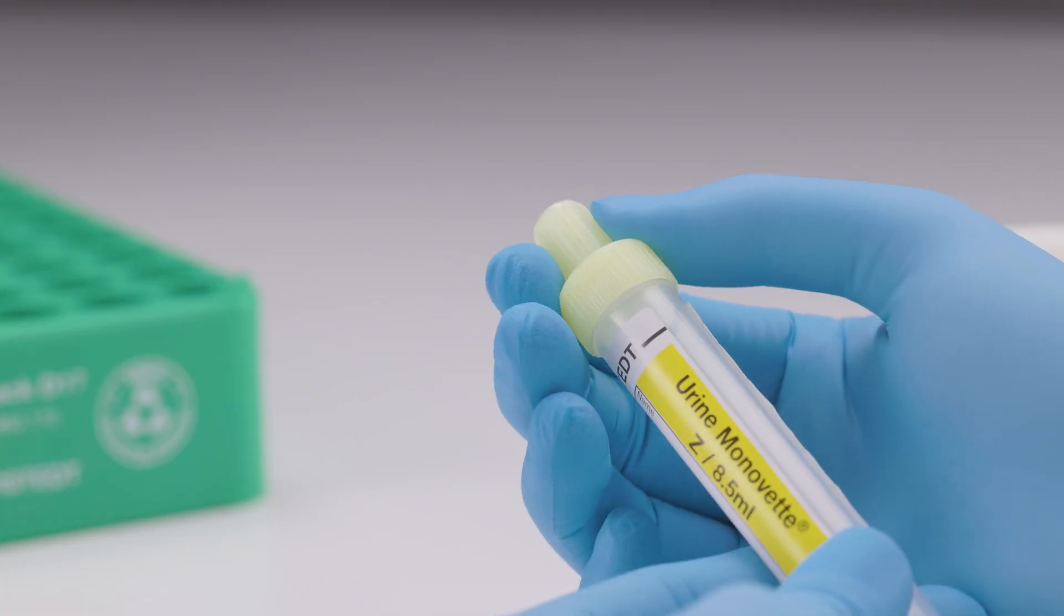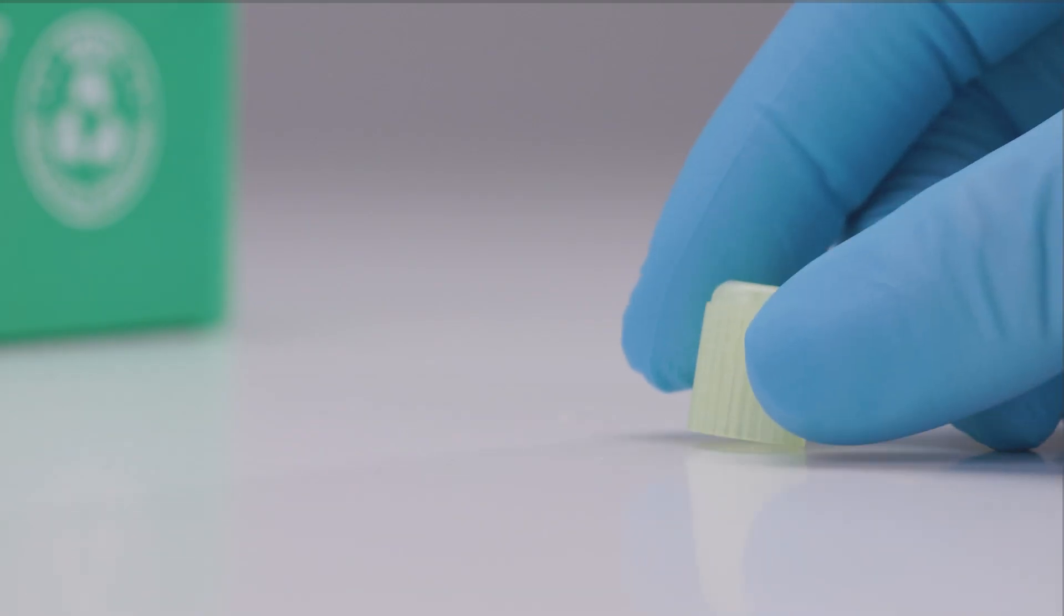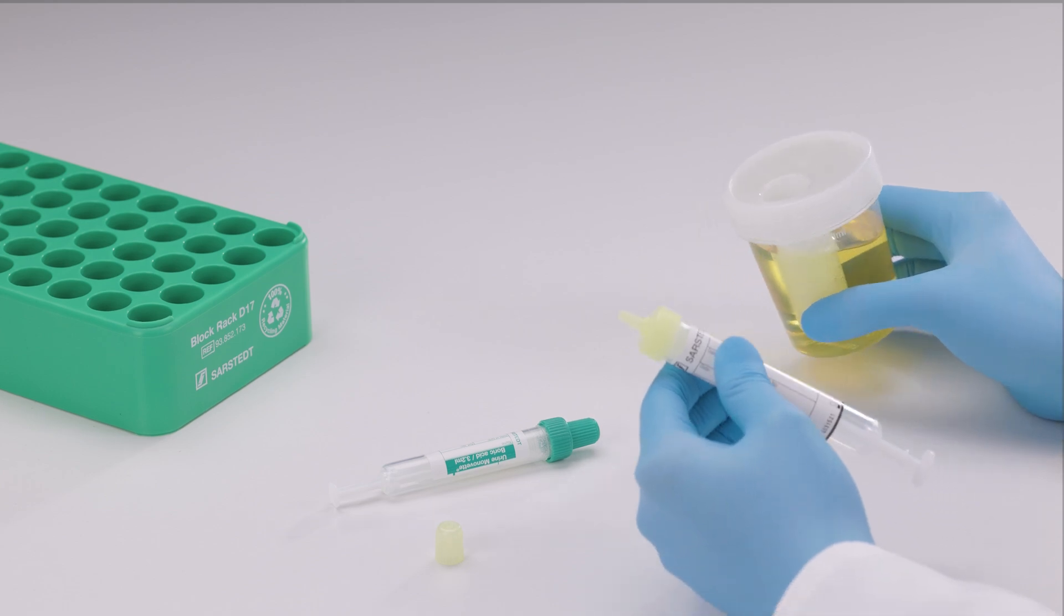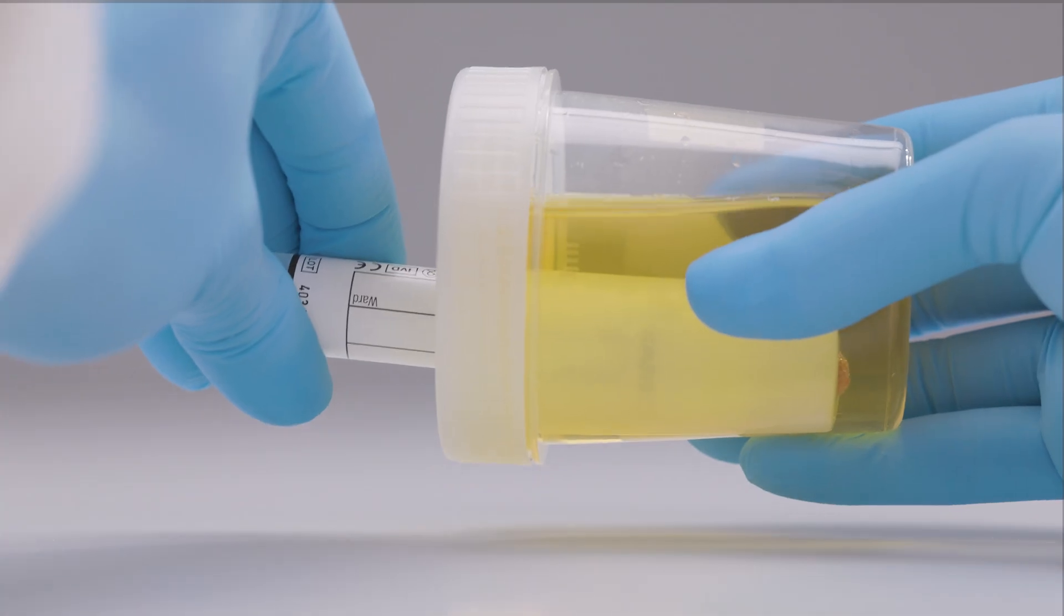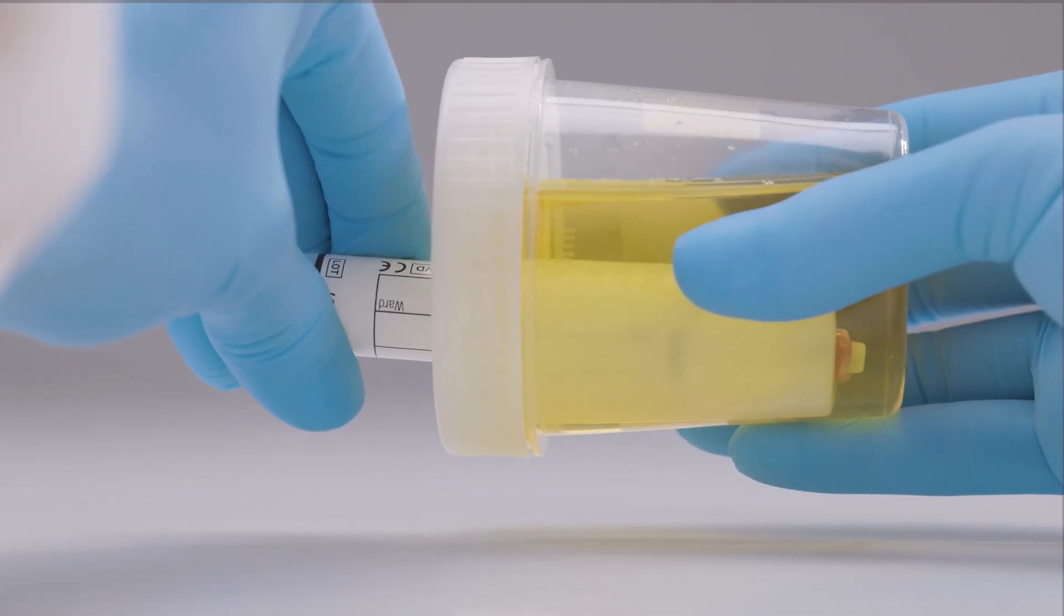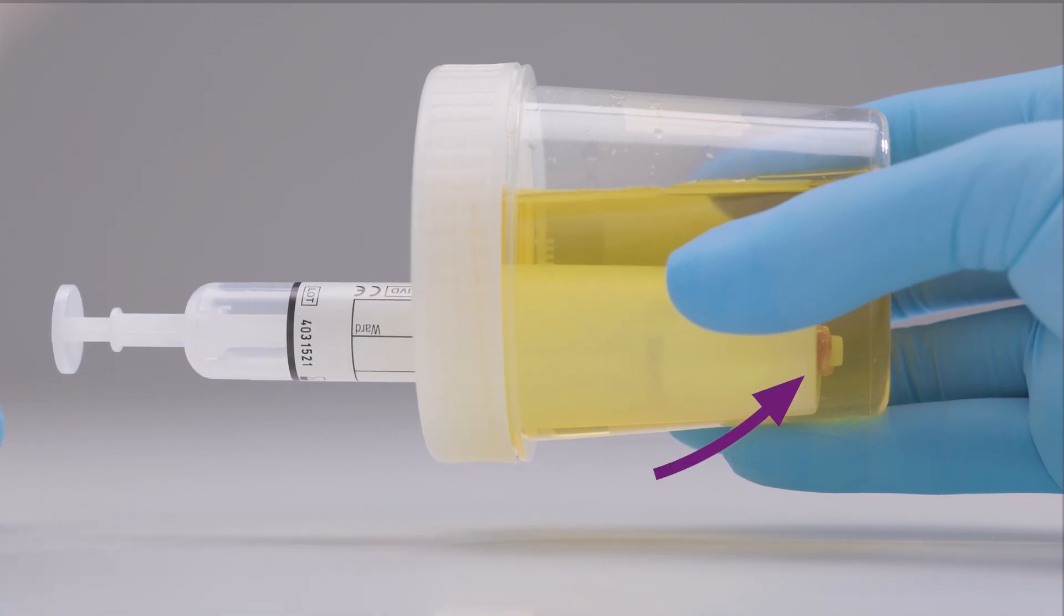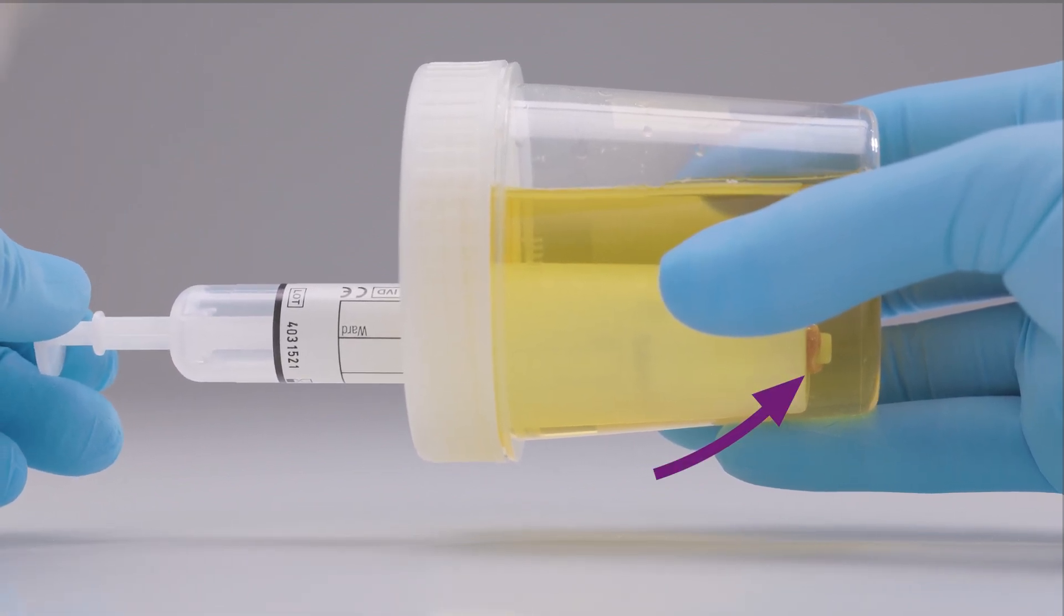Remove the stopper from the tip of the urine monovette and set it aside. Place the NFT cup on its side and guide the tip of the urine monovette into the needle-free transfer unit, ensuring that the tip penetrates the NFT membrane.